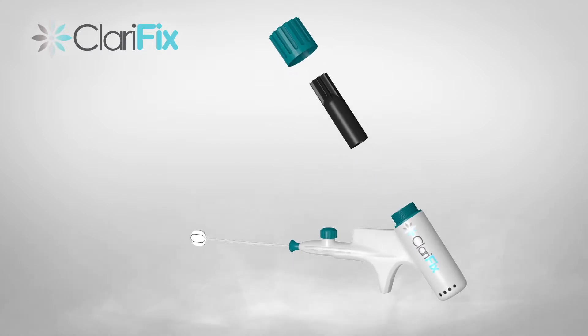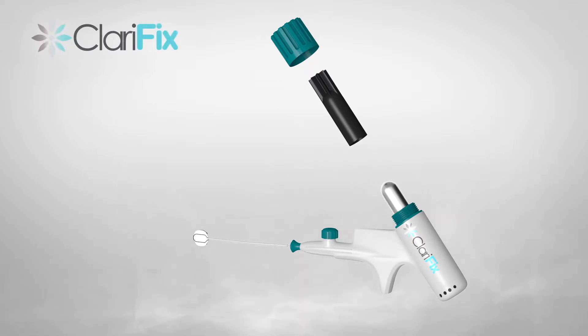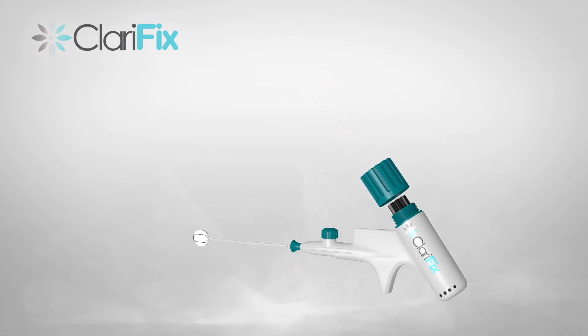To prepare the Clarifix device, verify the valve is in the closed position. Unscrew the cap and remove the adapter and cap. Load a cryogen canister into the adapter and reinsert the adapter and cap back into the device. Tighten the cap until all threads are covered.